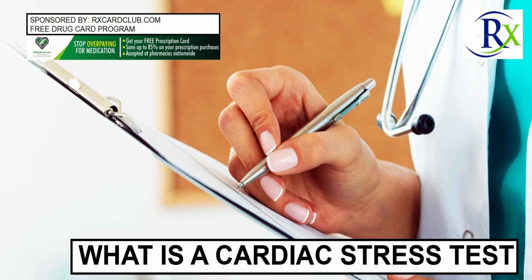Before the exercise portion of the test begins, the technician will record your ECG, pulse, blood pressure, and blood oxygen level at rest. These serve as baselines that your other results will be compared to. Throughout the testing. After the resting results are obtained, the exercise portion of the test begins. The exercise is graded, meaning that the intensity is increased every 3 minutes by raising the speed of the machine and or adjusting its resistance or incline.